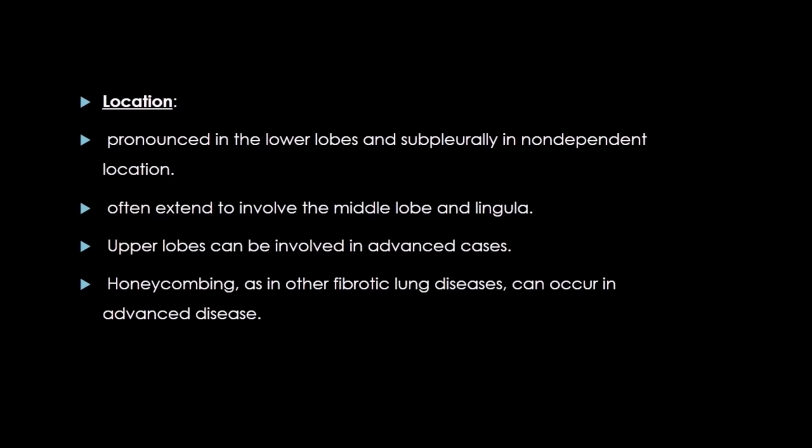Location: it is usually pronounced in the lower lobes and subpleurally in non-dependent locations. Often it extends to involve the middle lobe and lingula. Upper lobes can be involved in advanced cases. Honeycombing, as in other fibrotic lung diseases, can occur in advanced disease.